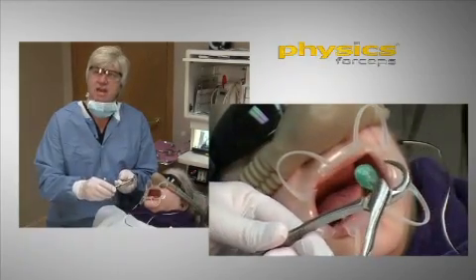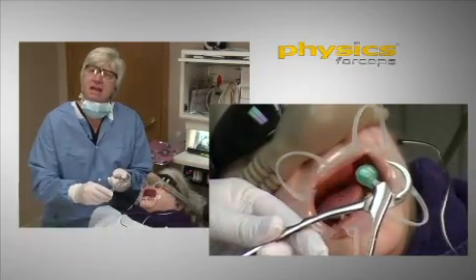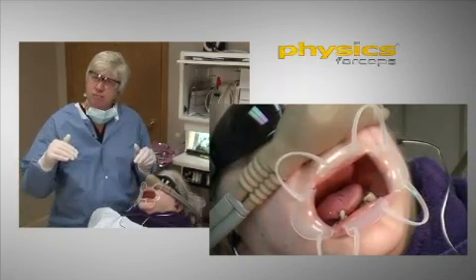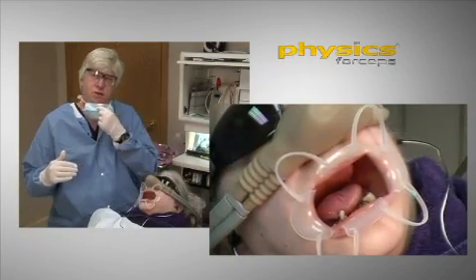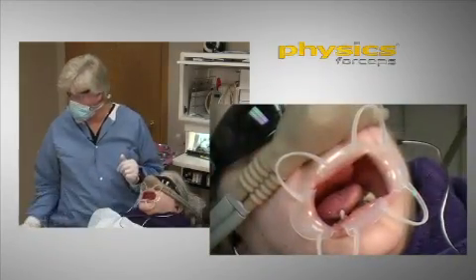So what I'll often do is just take a surgical burr — a diamond, whatever you want — and flatten the lingual surface of the tooth, subgingival, maybe 2 or 3 millimeters, 4 millimeters, just to give us a purchase point of where we want things to be.